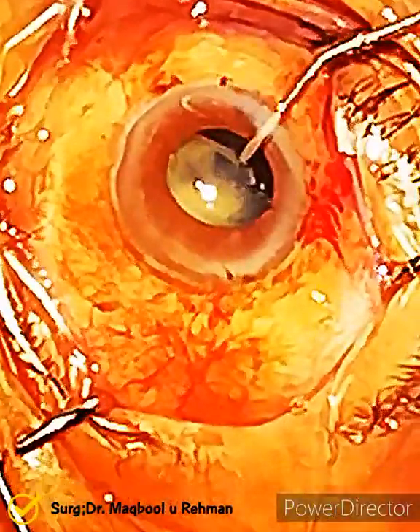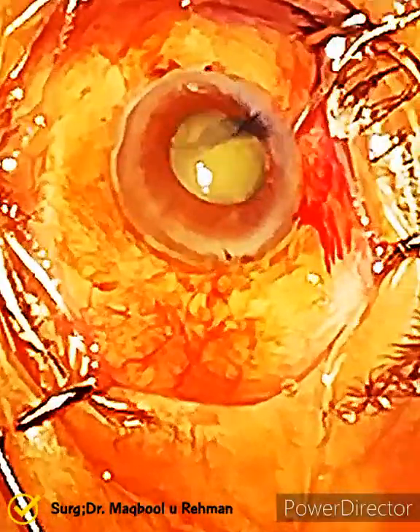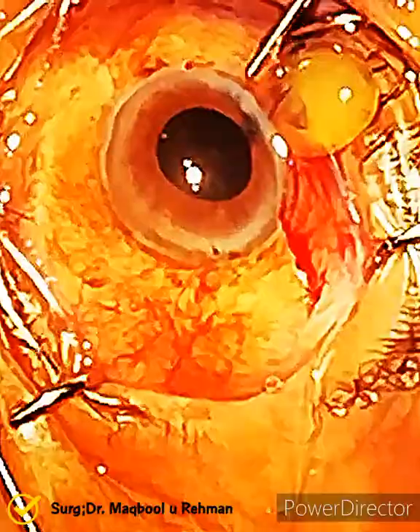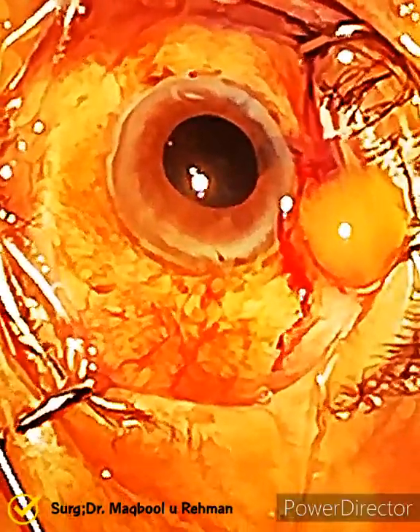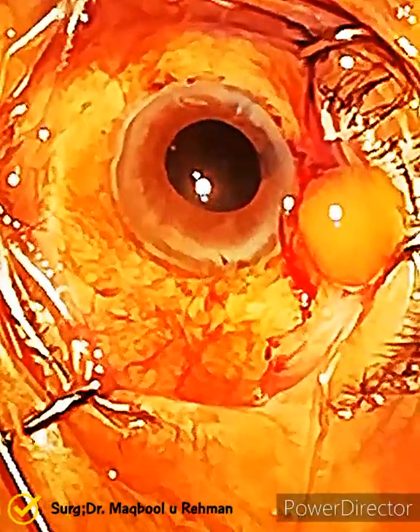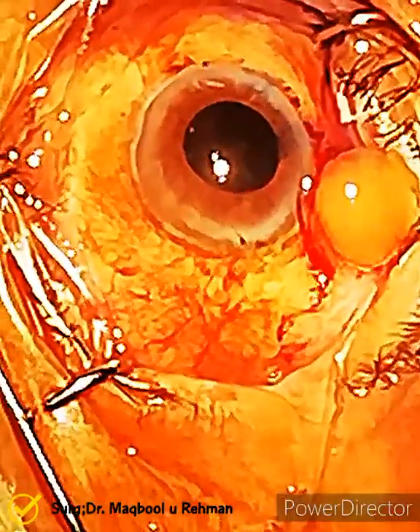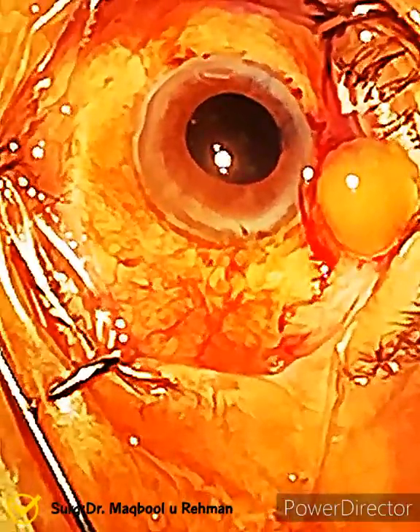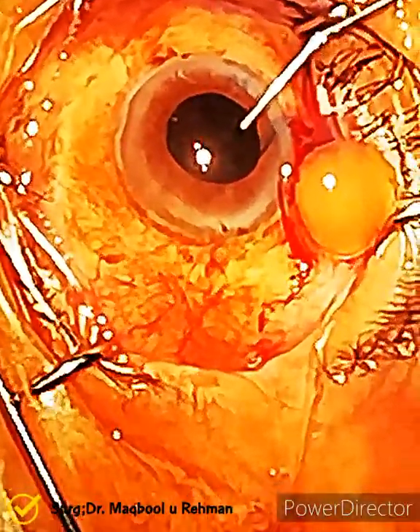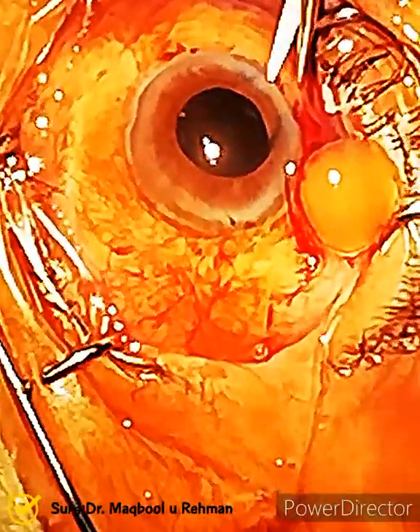I think he is doing visco-expression — putting viscoelastic in. The nucleus came out; it's so tiny. Best of luck for the patient. If he has some good vision, he was feeling positive in both eyes.